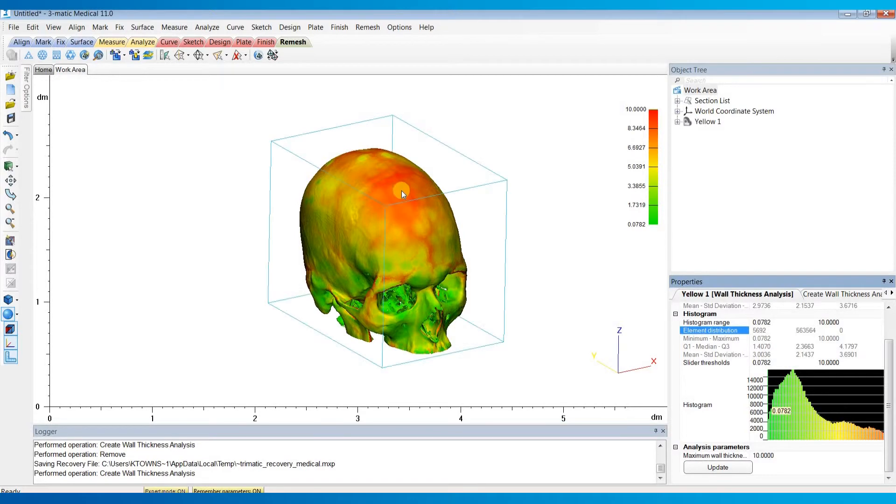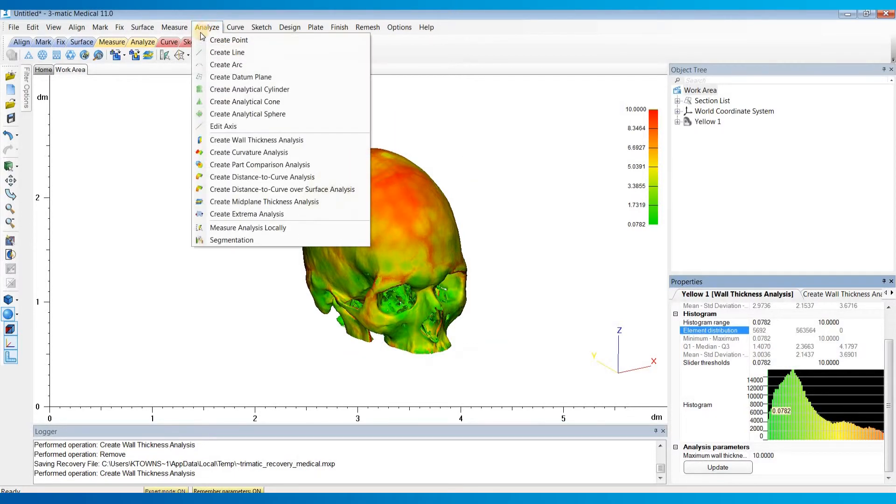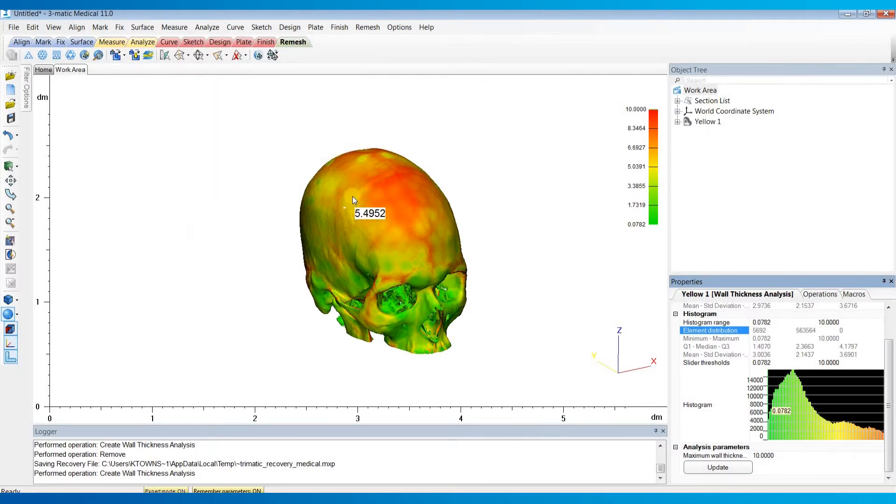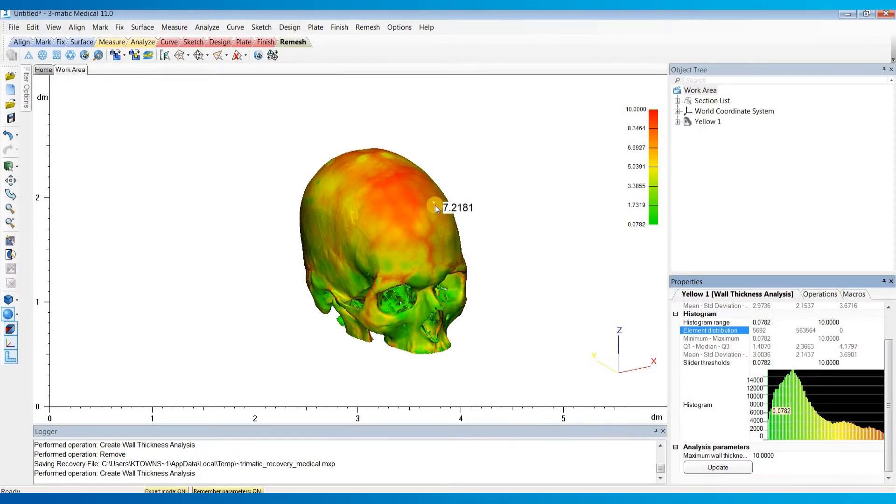So if you do want to see the thickness value of a very specific point, you can go to the Analyze menu and do Measure Analysis Locally. And then you can move your cursor around and get values for very specific points.